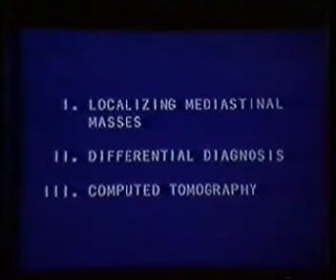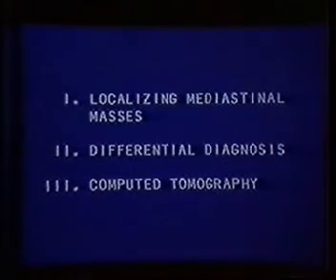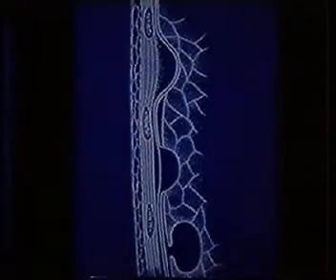Mediastinum is clearly an area where radiography still plays an important role because it is just not accessible to direct examination. Radiologic studies are really very important in evaluating this region, in particular for mediastinal masses. So what I thought I would do is take us through this by looking, first of all, at localizing mediastinal masses, and then a little bit about differential diagnosis, and then some observations we've made with computed tomography.